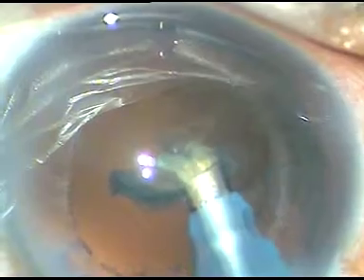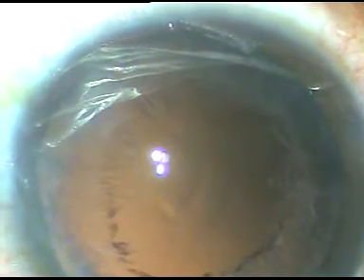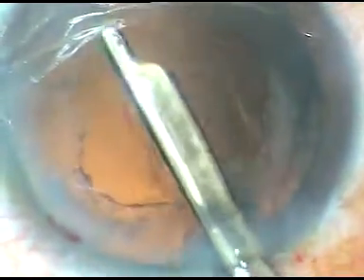I check the stability of the chamber at the last fragment and then remove the chopper, make the anterior chamber deep. The posterior capsule also goes backward, and then I emulsify the last bit, be it epinucleus or nucleus. That's it. So I have managed the nucleus using this small rhexis. This is not so small, but I want to enlarge this after implanting an intraocular lens.